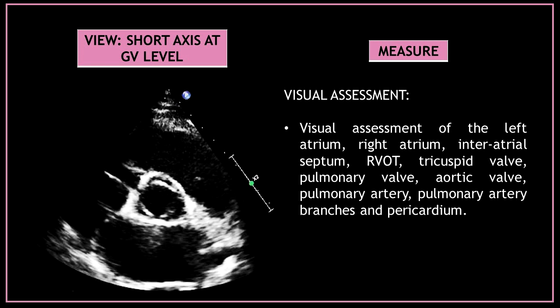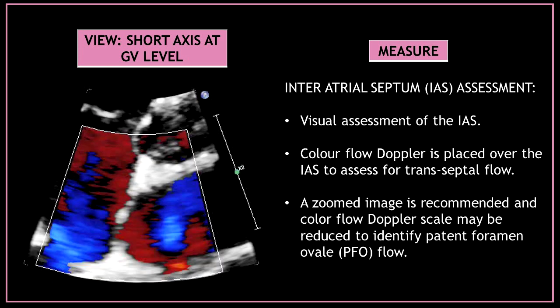After you do a global visual assessment, you can start to analyze each structure individually. You can start with the interatrial septum — do a visual assessment, then use color flow Doppler over the interatrial septum to assess for transseptal flow. A zoomed image is recommended and the color flow Doppler scale may be reduced to identify PFO flow.